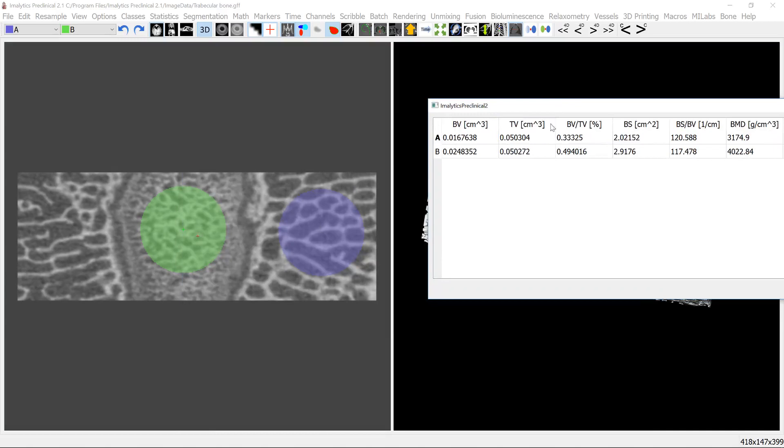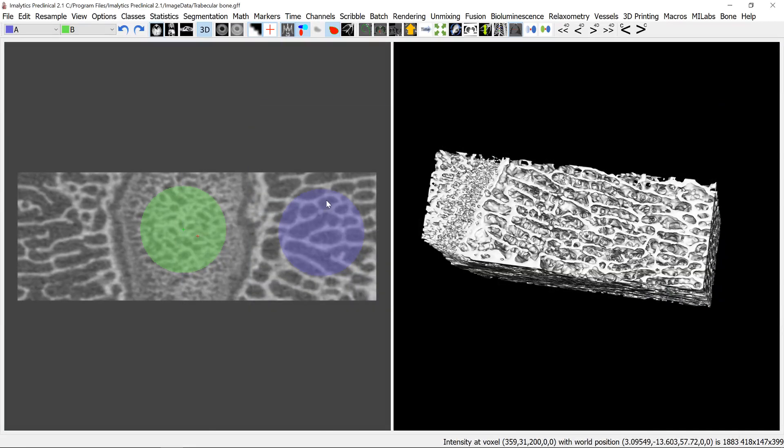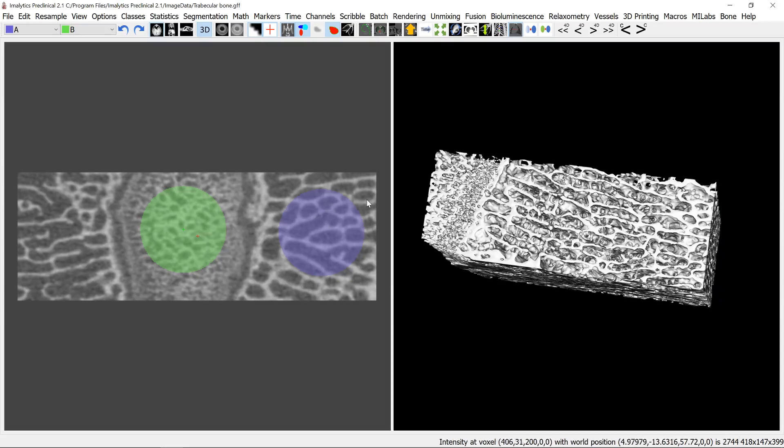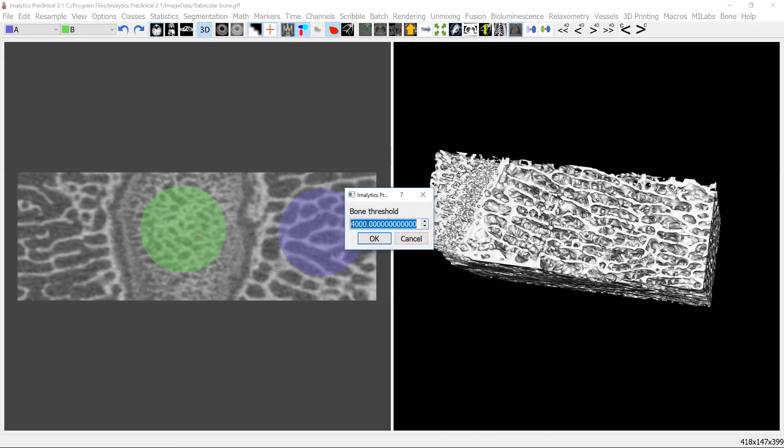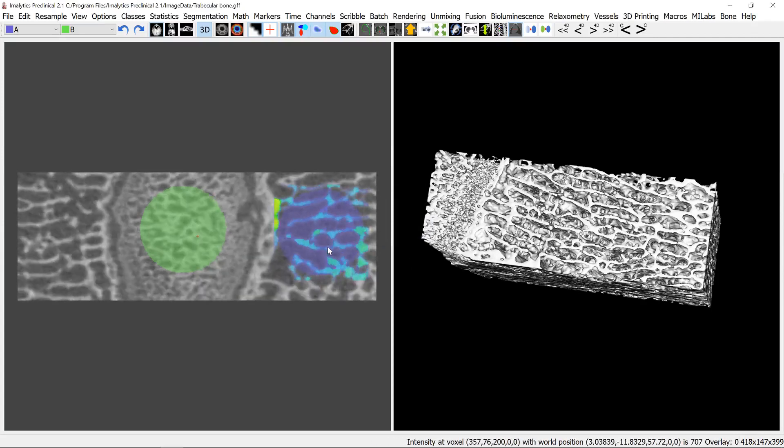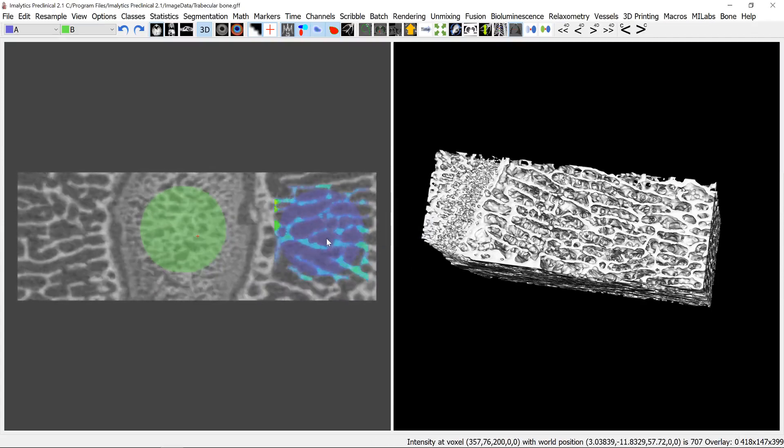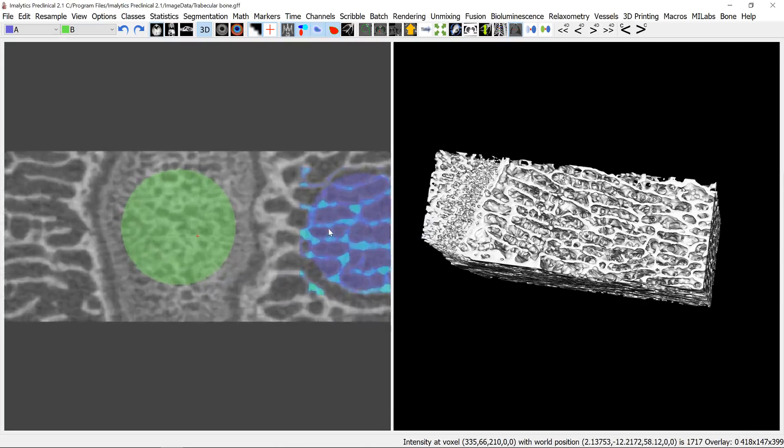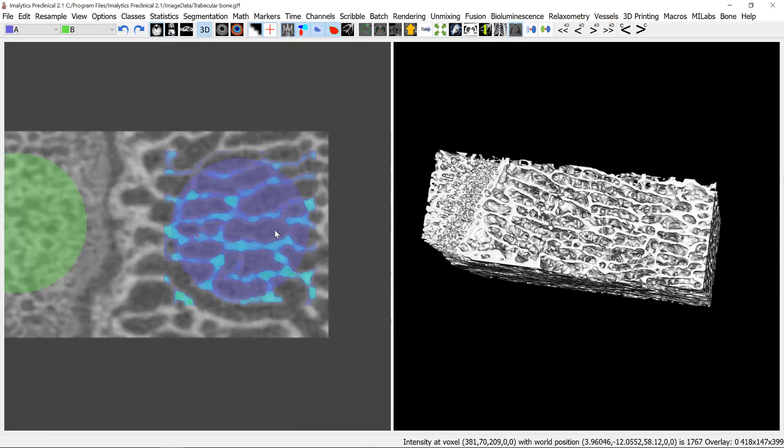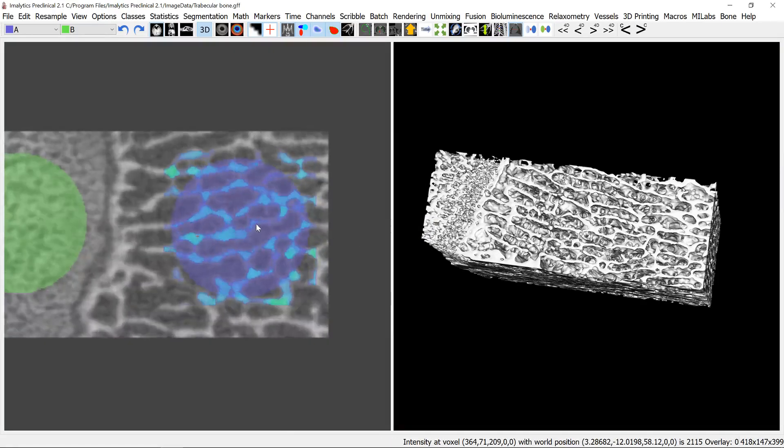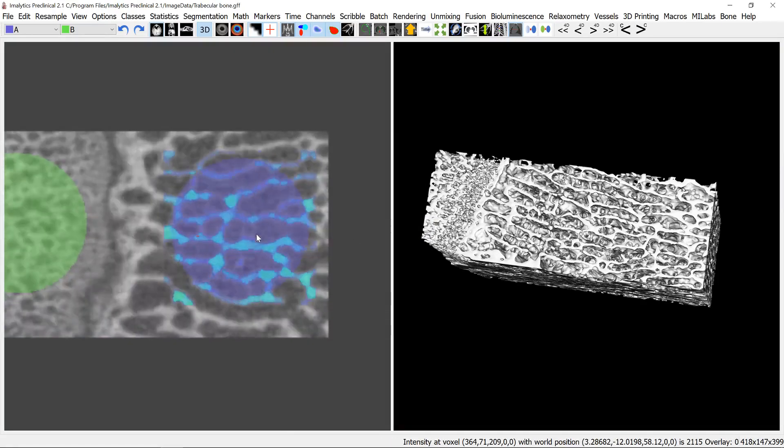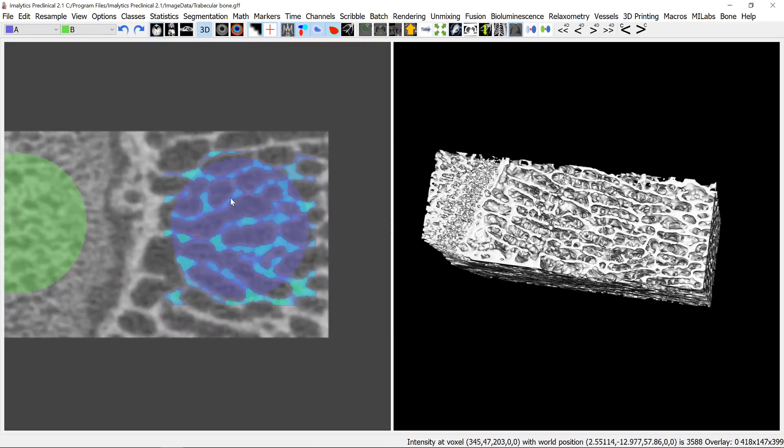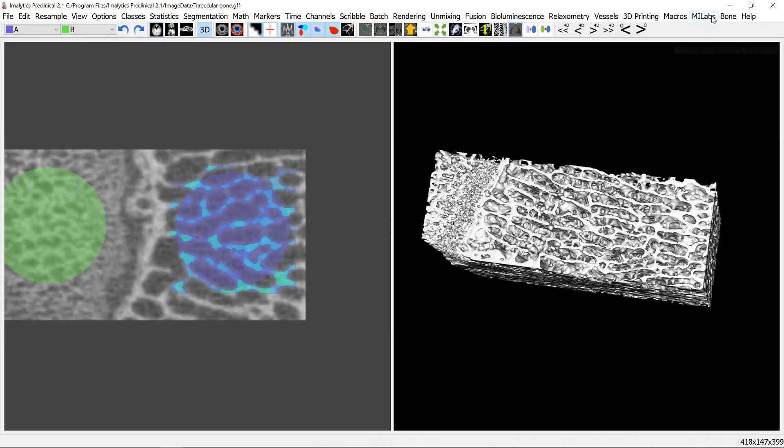So how does this actually work? What the software does, it's computing a so-called local thickness map. I can do this here for class A showing this as overlay now, and it's fitting a lot of small spheres actually into the bone region here, then it's computing the mean of that.